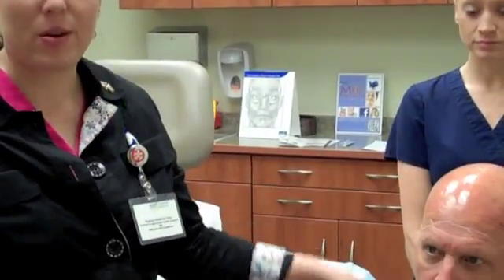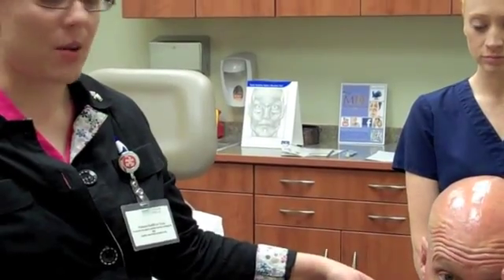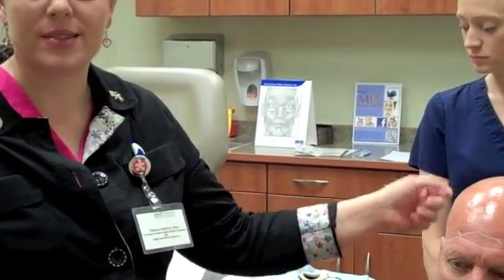Welcome back to our photodynamic therapy video. Mr. Stevens has now had his amino levulinic acid sitting on the scalp skin for about 90 minutes. About 30 minutes ago we had him come back in and we applied a topical numbing cream to the entire area to be treated. We do that for most patients so that they feel a little bit less burning and stinging with the first five minutes of the treatment.